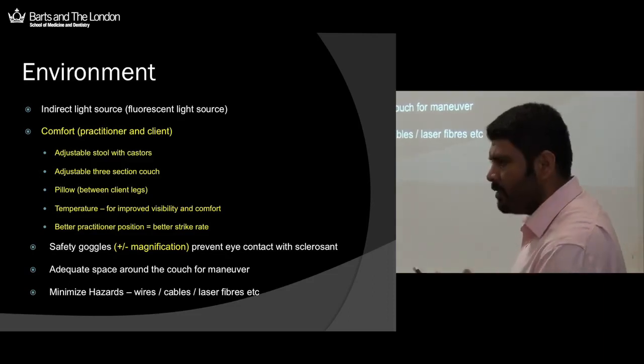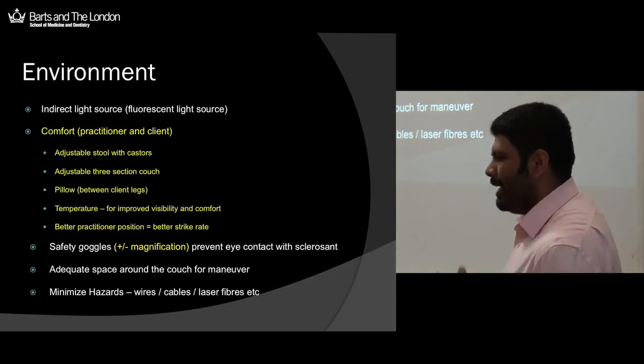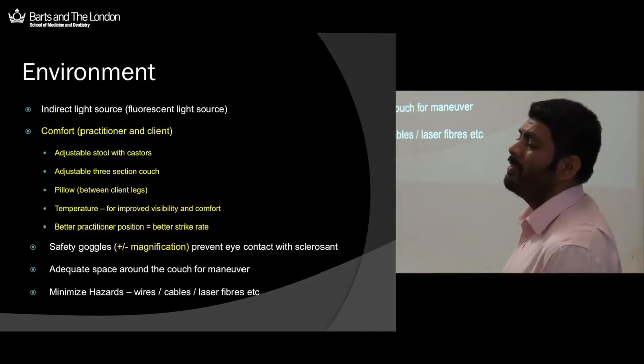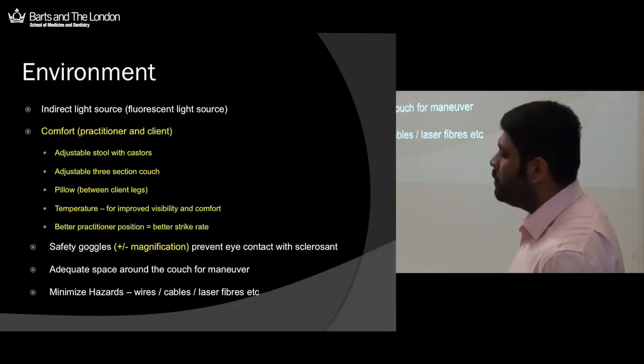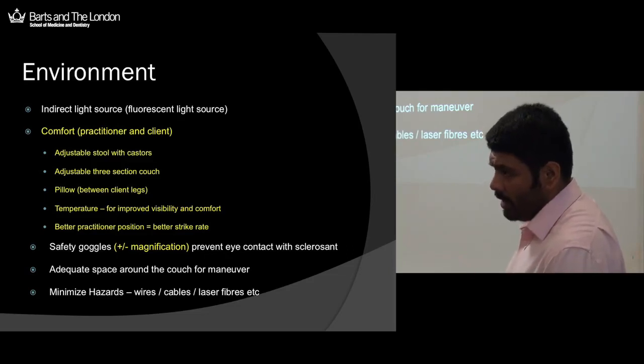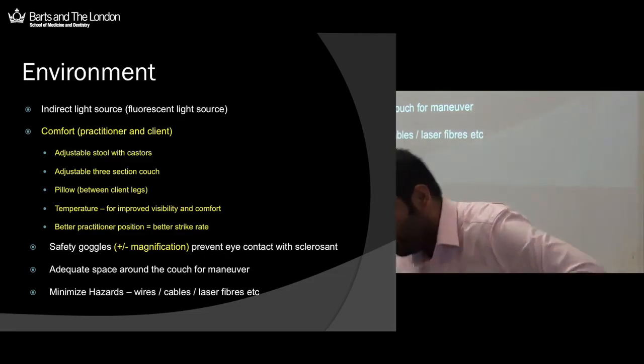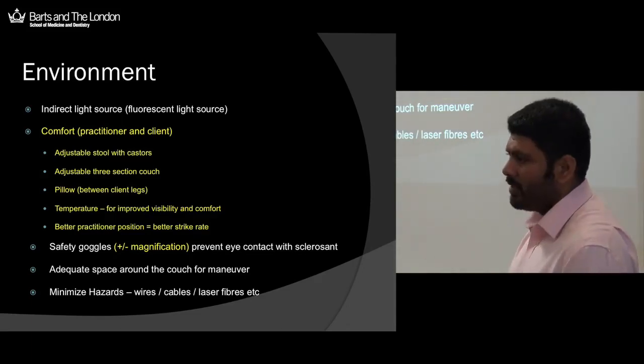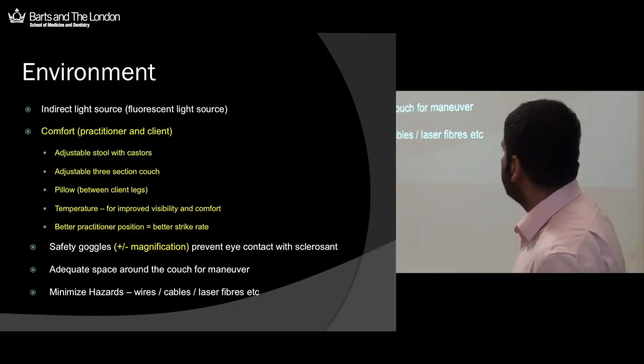The comfort of the patient is important, because it's a very fine injection procedure. These are very small targets, you're using very small needles, and the veins are almost the size of the needle. So if you don't make sure the patient is comfortable and not moving around, and if you are not comfortable and you're bending over and trying to hold your body position one way, you'll fail with your injections and you won't give them a good result. Obviously, with sclerotherapy, the result is dependent on cannulating the veins.